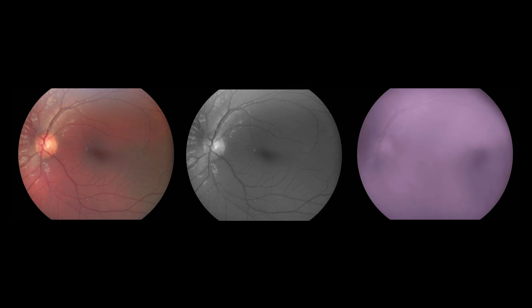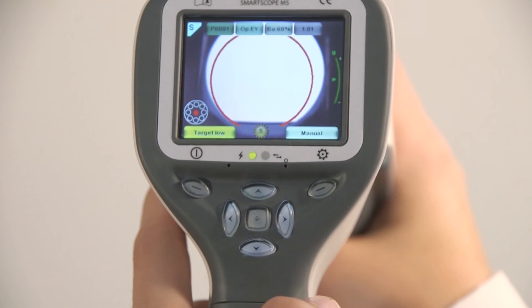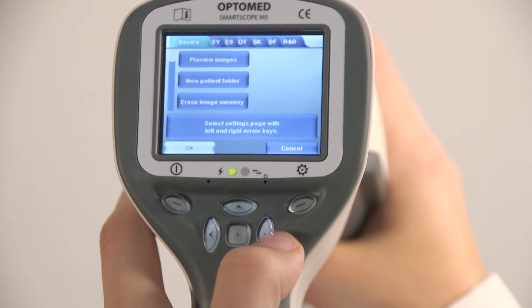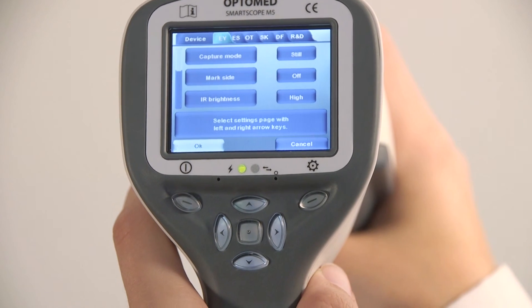It is possible to capture and save three images with only one shot: color, red-free, and IR images. This feature is enabled in the EY menu. Some other image settings such as capture mode and illumination mode can also be changed in the EY menu. To activate the menu, press and hold the right soft key. If you need more information about menu functions, please visit us at www.optomet.com/training_material.